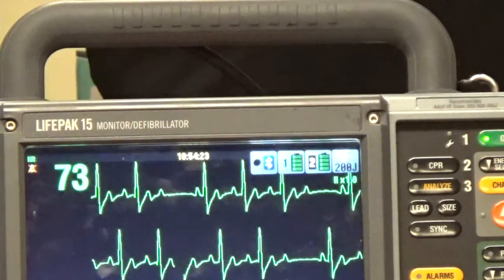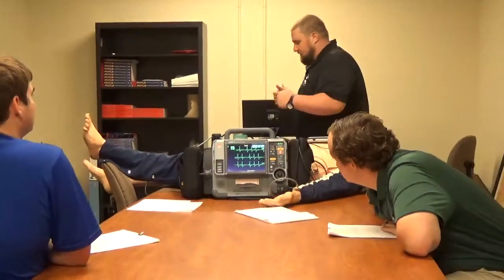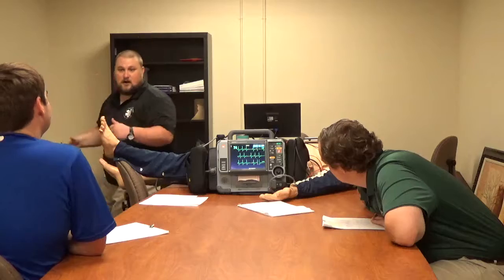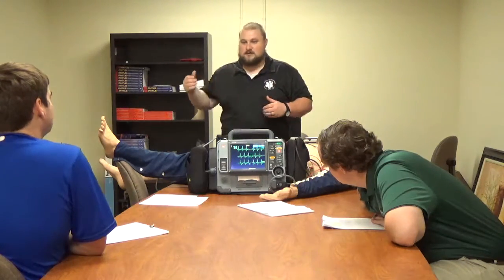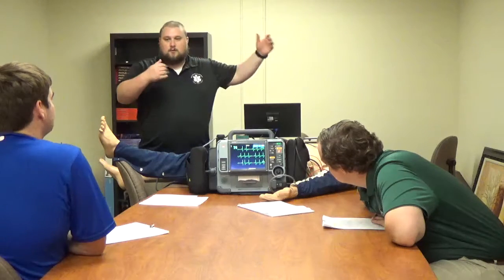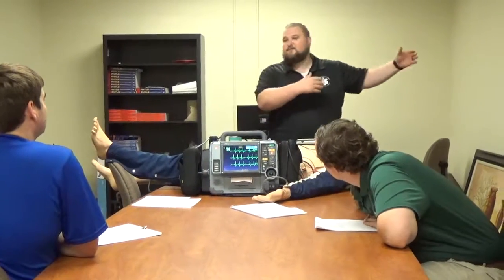I like to call second degree type 1s the walking Wenckebach. If you watch that PR interval, it walks out, walks out, walks out, it drops. Starts all back over, walks out, walks out, walks out, drops. You notice how I walked out, walked out, walked out, drop? That's 3 to 1. If it was to walk out 4 times, it'd be 4 to 1.